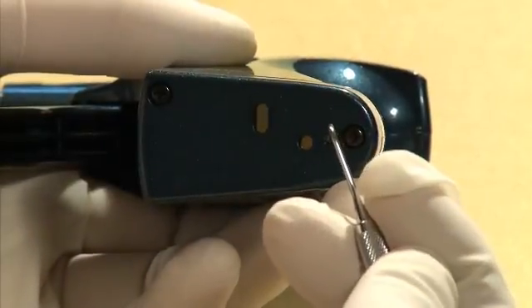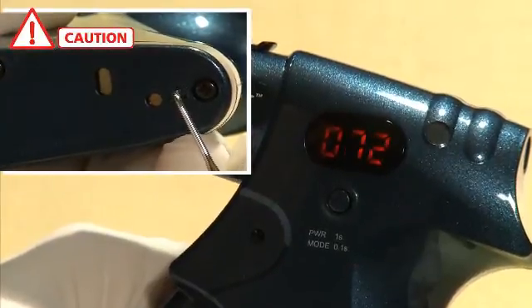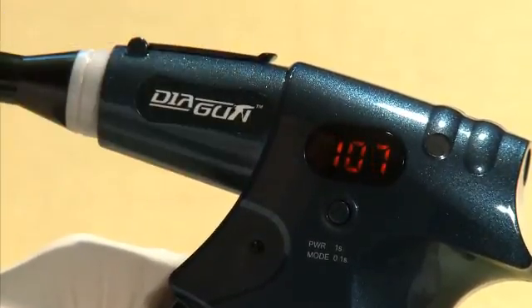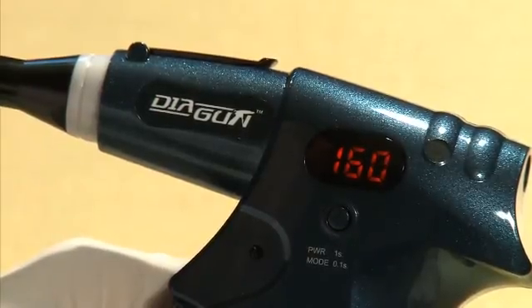Before using Diagon for the first time, it is extremely important to press the reset button located at the bottom of the Diagon handpiece. Failure to do so will result in Diagon malfunctioning in the future.